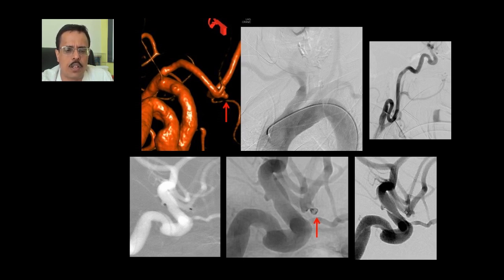Even very small 1 mm aneurysms we are now coiling with a 1 mm coil. This is a patient with a very small 1.2 mm anterior communicating artery aneurysm with extremely tortuous anatomy in both the aortic arch and the ICA. We managed to take the microcatheter to the neck of the aneurysm and placed a 1 mm coil with complete thrombosis.